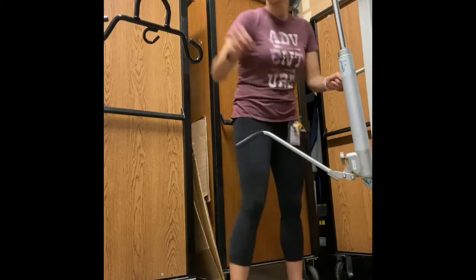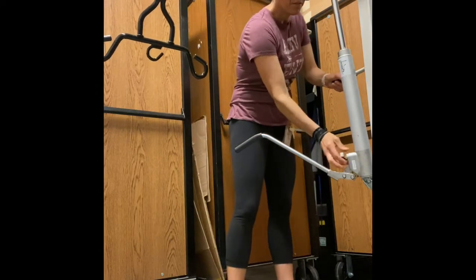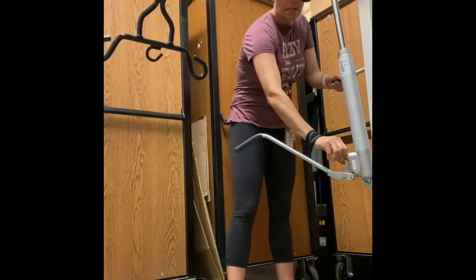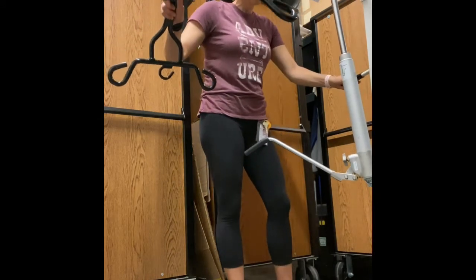If I just open it all the way up with the patient's weight in here, it would drop really fast. So until you're very comfortable knowing exactly how much to open it, you want to open it very, very slowly, because we definitely don't want a patient dropping.